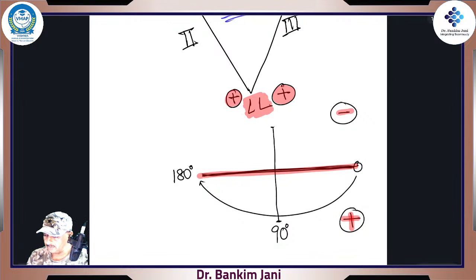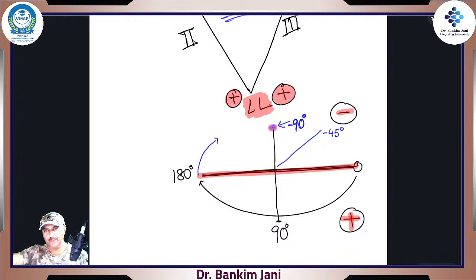So my next question is, what degree would this be? This one. What would be the degree? Exactly. Very good. This is minus 90. Theek. So from minus 180, things will start going in this direction. Right. And gradually over here, something which is absolutely in between would be minus 45. Right. And then minus 45, 44, 43, and then minus 3, minus 2, minus 1, and then 0 degree. And once again from here, 1, 2, 3, 4 degrees would start.